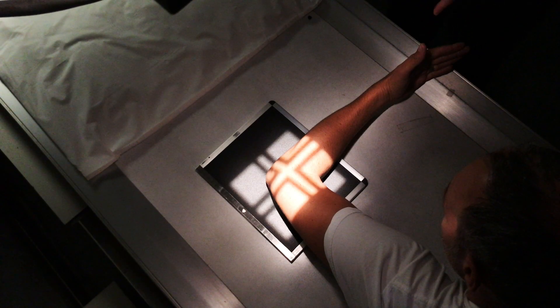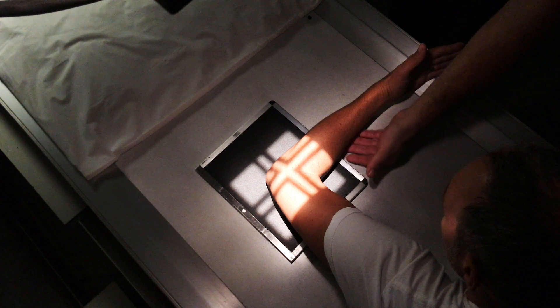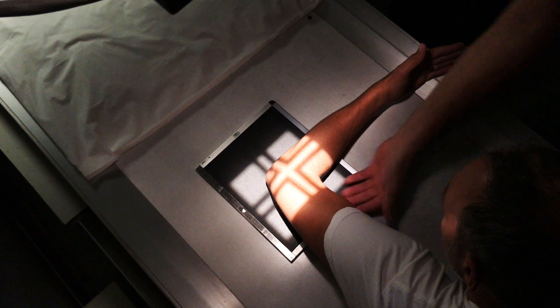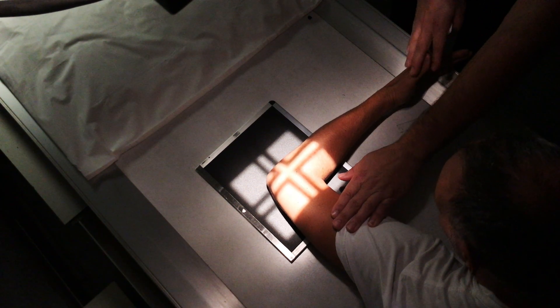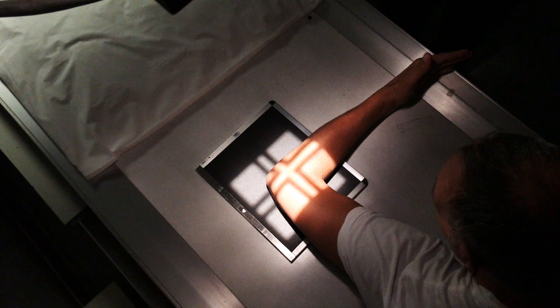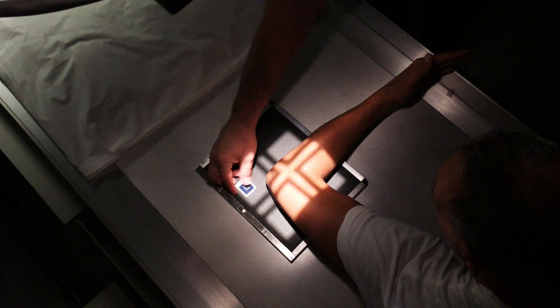Our next view is going to be lateral. Make sure that you have contact with the forearm and the humerus. Go ahead and lean your patient forward, or put them on a lower stool if you need to bring their arm down for that contact. Make sure that the arm is bent at a 90 degree angle, and always mark your image receptors.